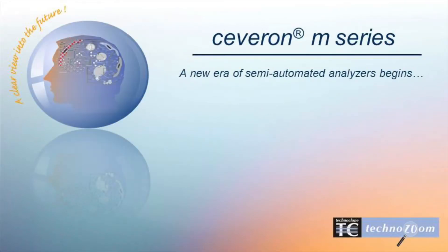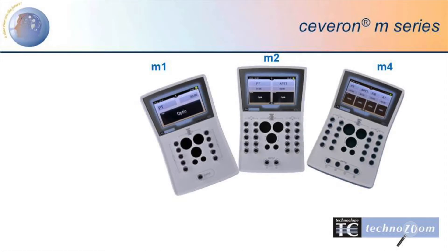The new ceveron m series is an easy-to-use semi-automated coagulation analyzer. The touchscreen-operated instrument is available in three versions.